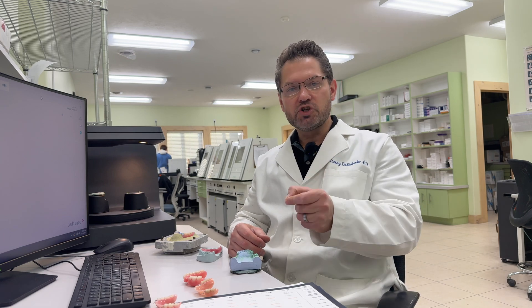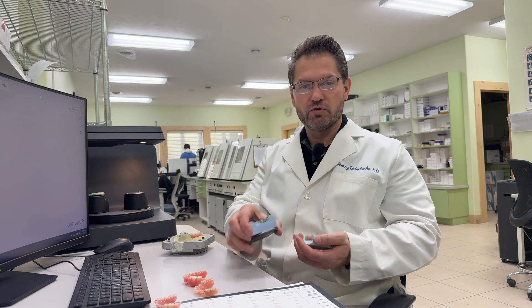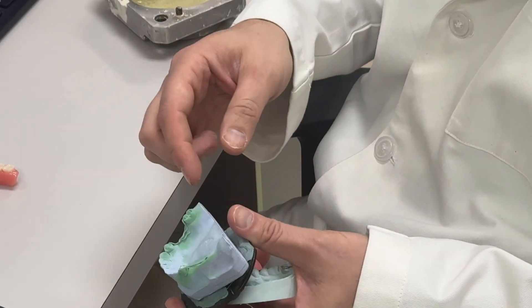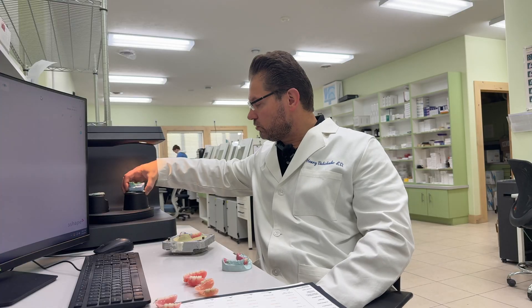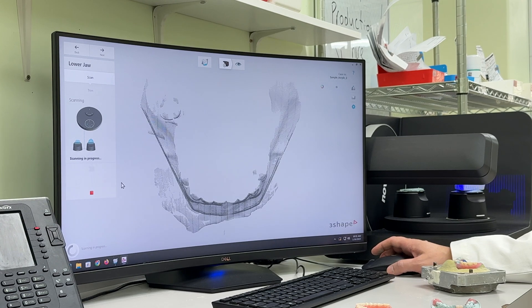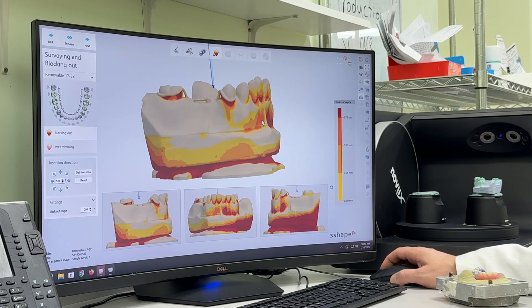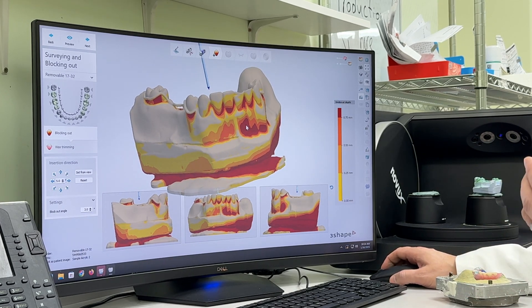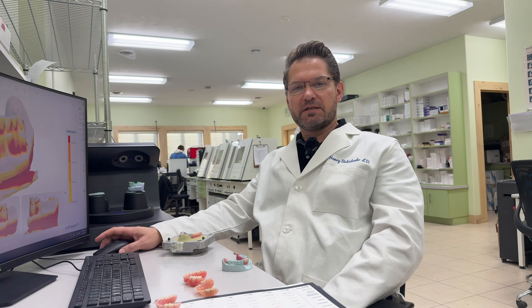Let's talk about how digitally fabricating this partial can improve the fit and aesthetics. The first thing you do is place the wire clasp onto the model, then go ahead and scan it. Right now, we're just scanning this model. When we scan the model, we can go ahead and black out all the undercuts.